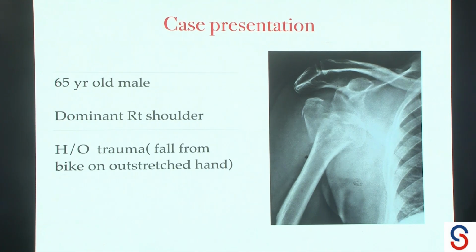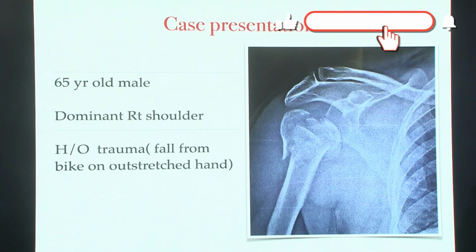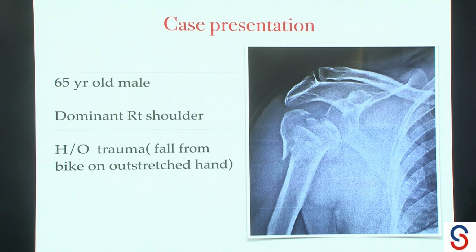After this X-ray, the primary doctor tried to reduce this fracture by closed reduction, and this is the result. Then he went to another surgeon, who asked for a CT scan, and on CT scan the things were clear, so he referred the case to us.